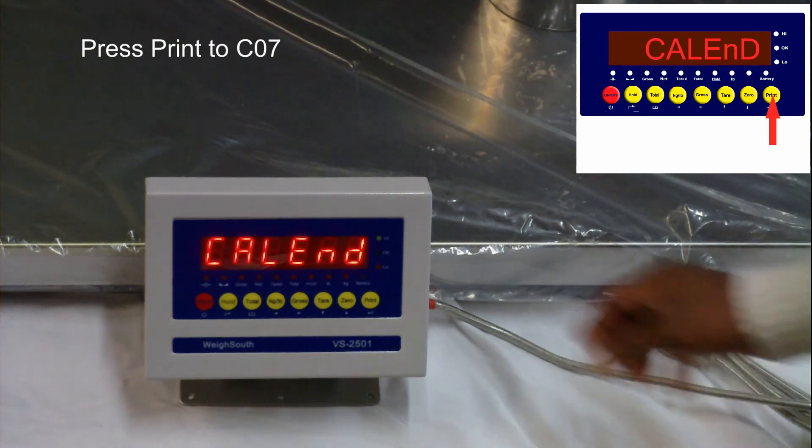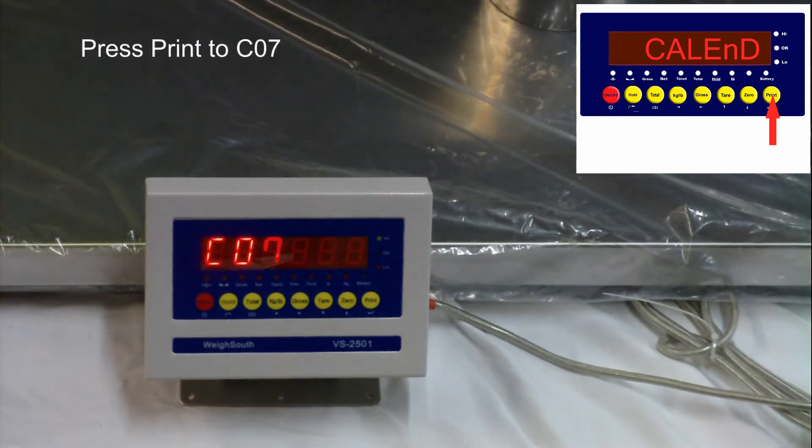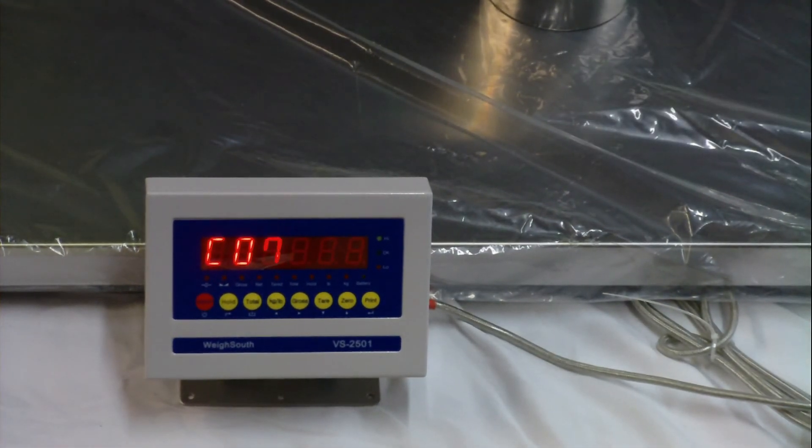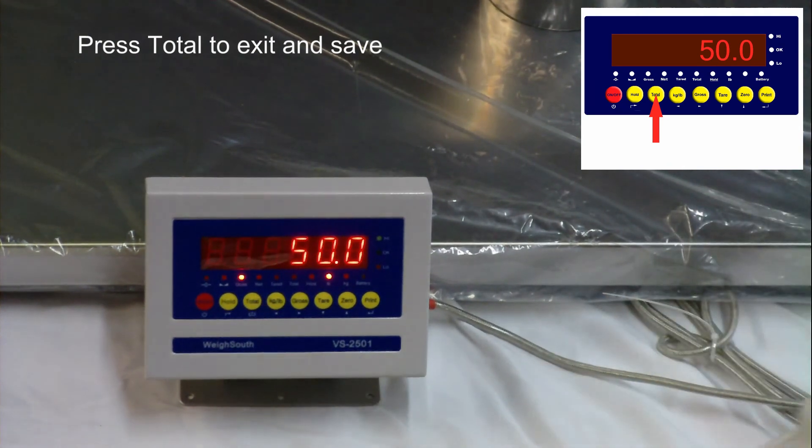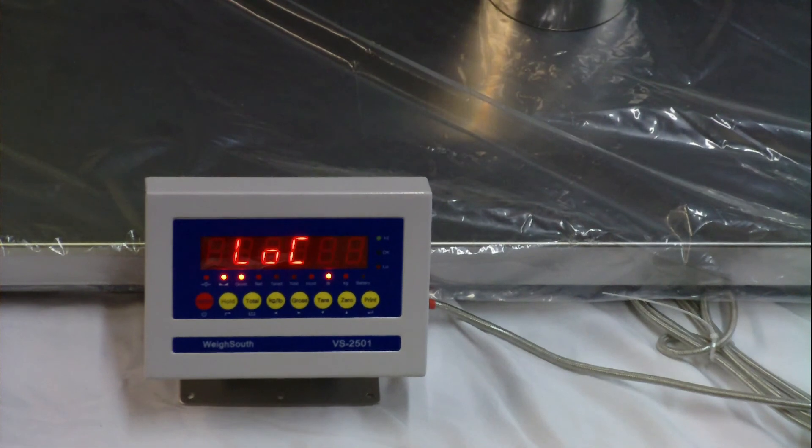Press the print key to move to the next function C07. At this time, calibration is complete and you can exit and save your settings by pressing the total key. The VS2501 returns to normal weighing and calibration is complete.